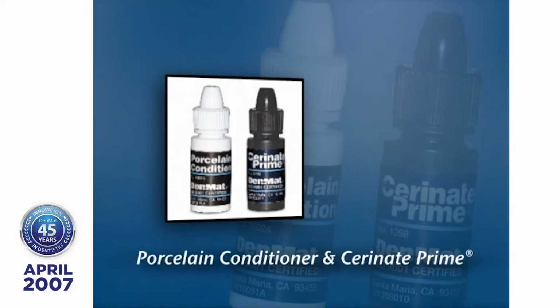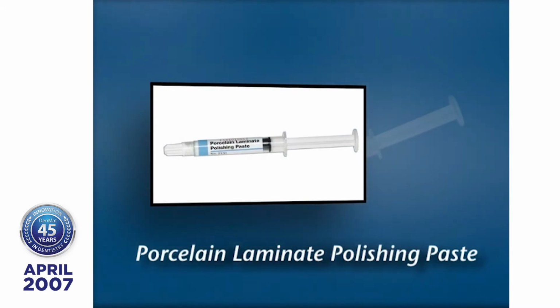She's polished his teeth with porcelain polishing paste because that has an enzyme in there to help get rid of the plaque on the tooth. So when we go to etch it and do surface treatment, we'll get a much more exposed surface, because plaque is really grease if you think about it. And then it'll give a better opportunity to prepare that surface.